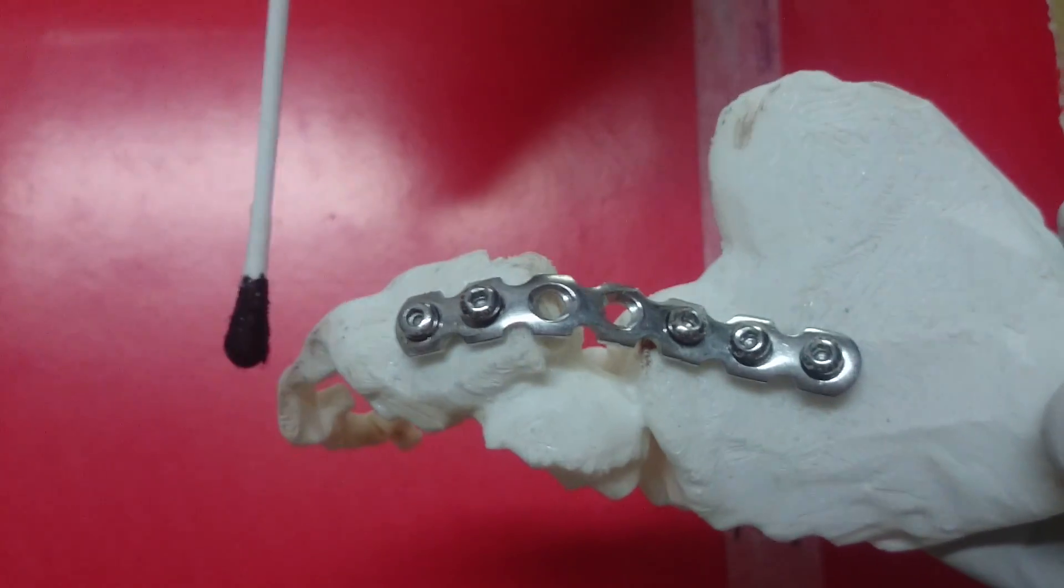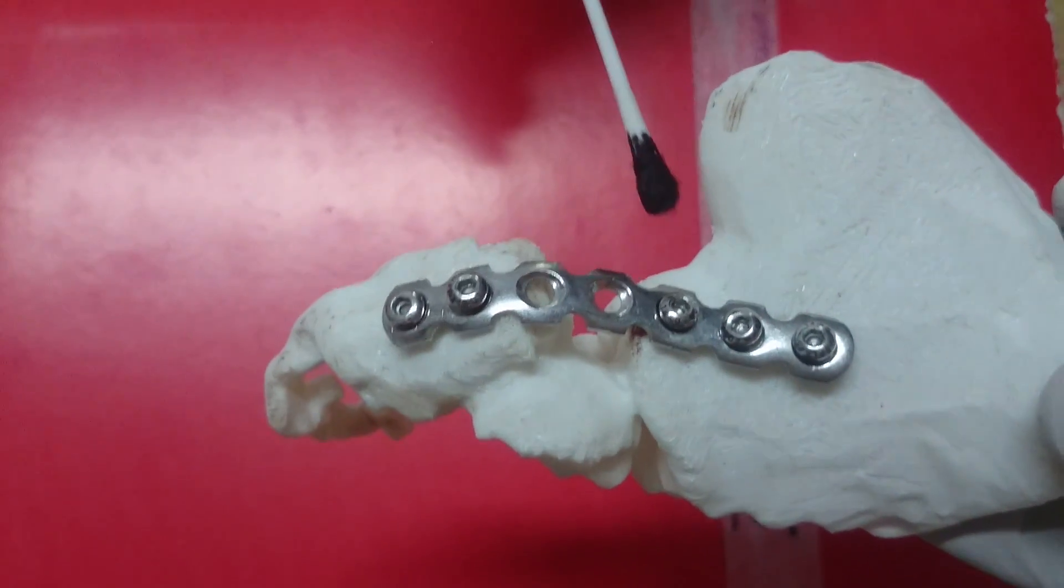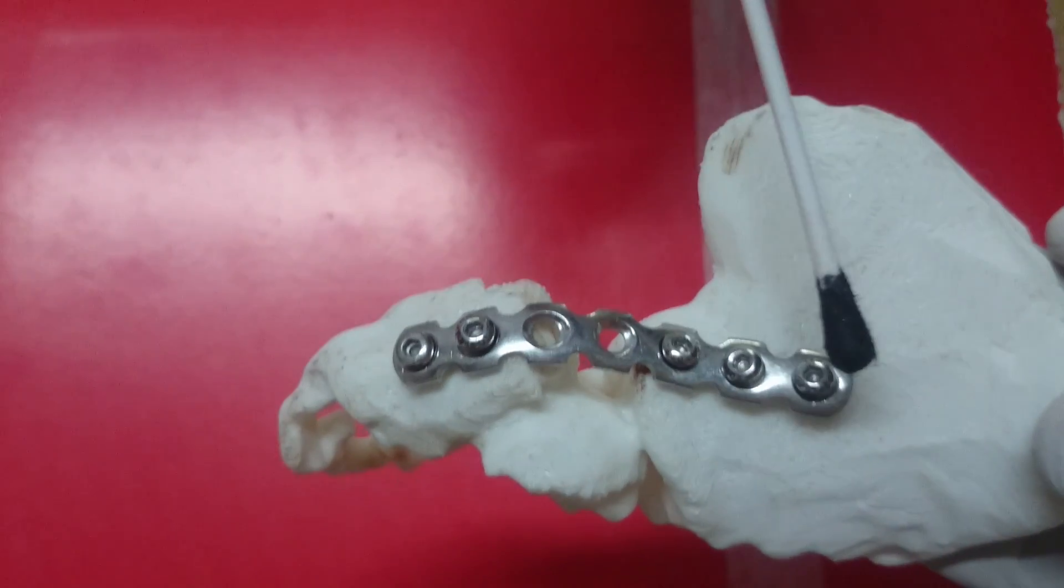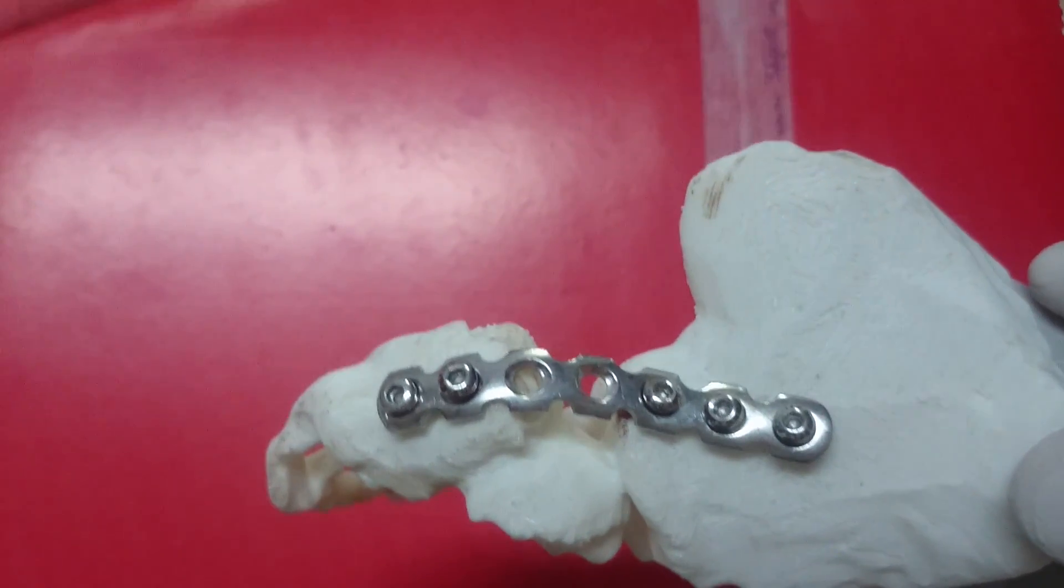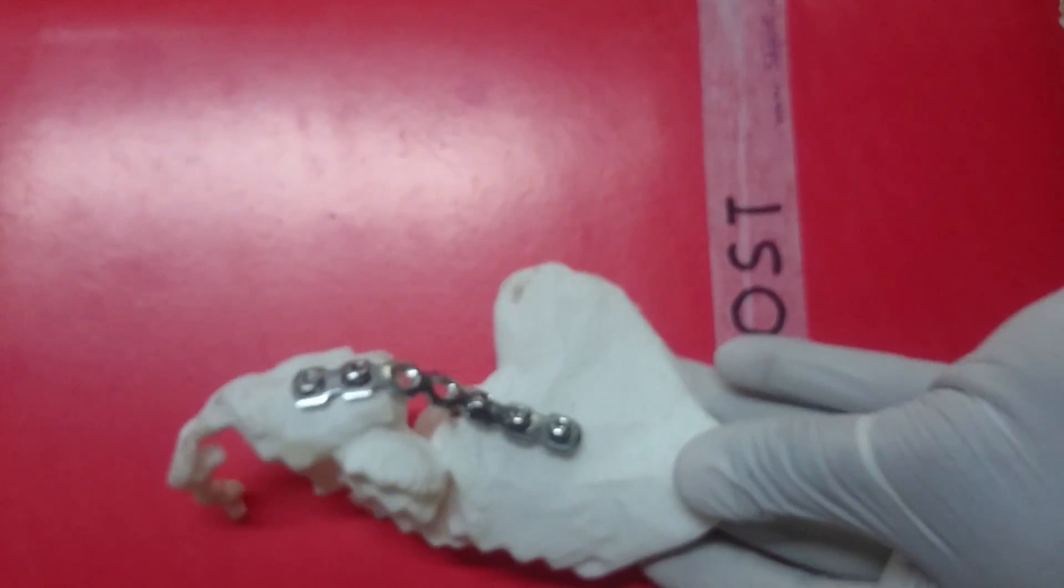This is the femoral head. This is the ischial tuberosity. This is the sciatic notch. This is the ilium. And this plate was then contoured with the help of these standard templates which are available.